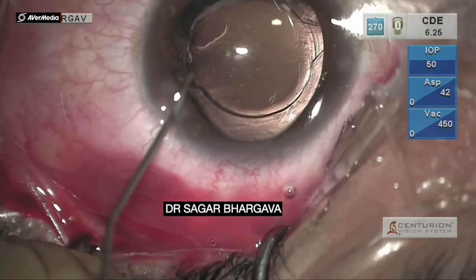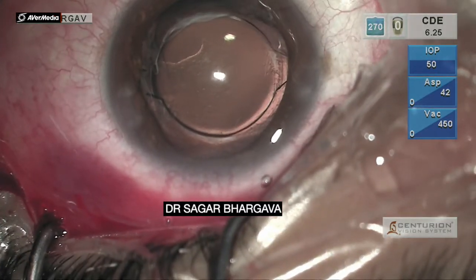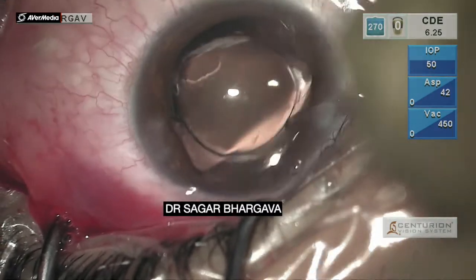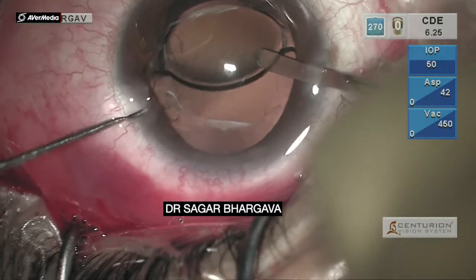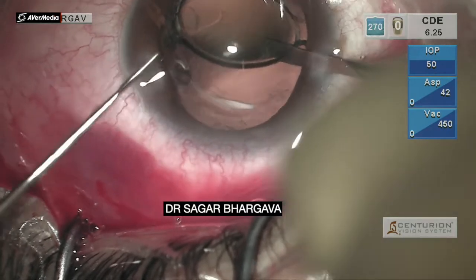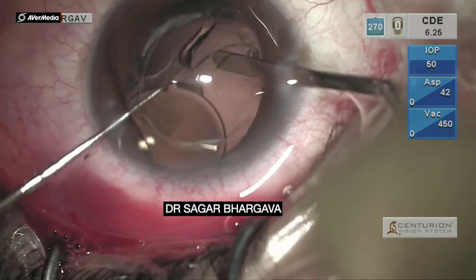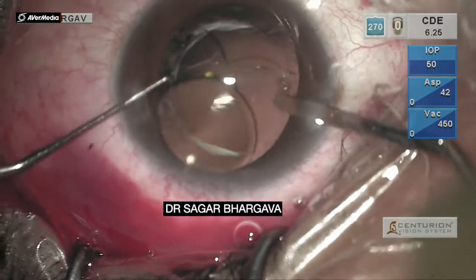We now concentrate on the other end. The optic is pulled away from the posterior capsule and the lens is supported by the iris spatula. A similar maneuver is done and this time it's much easier — the lens haptics just come out with a single stroke.